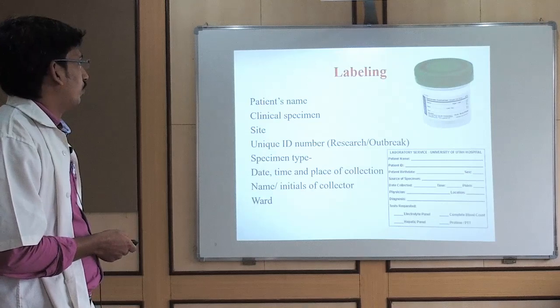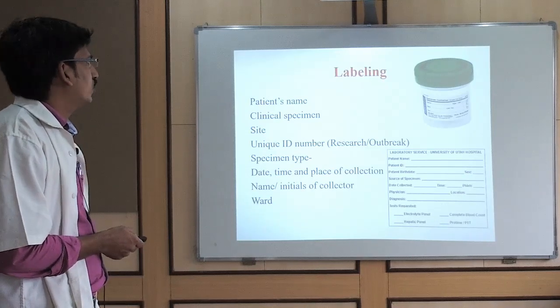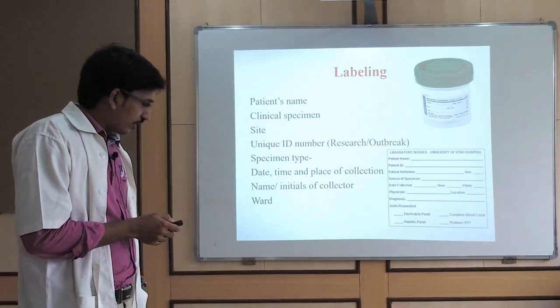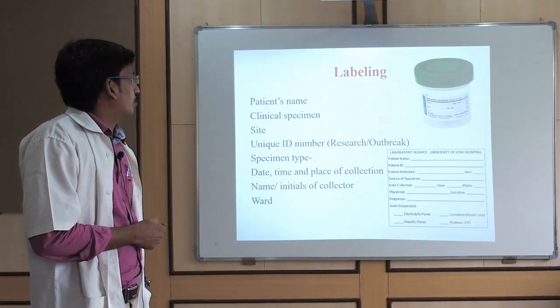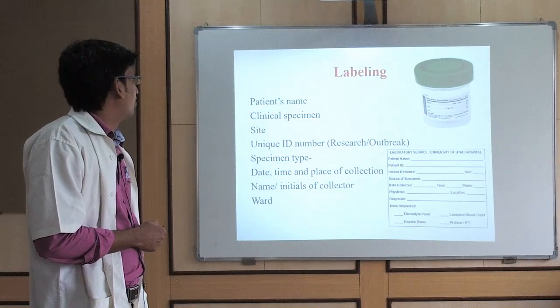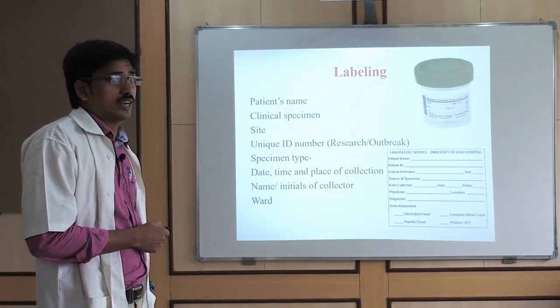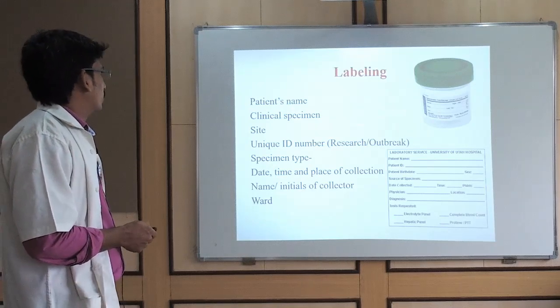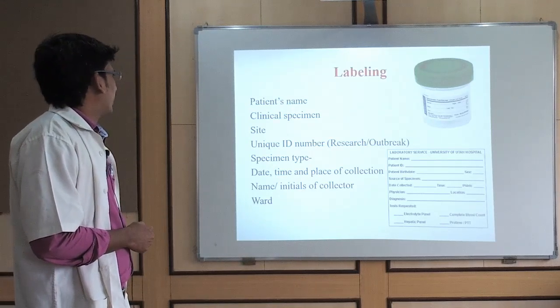Before collecting a sample, labeling is very important. Without proper labeling, you don't send any sample to the microbiology department. Coming to labeling, patient name is very important. You should write the patient name properly in bold letters. Don't write joining letters.